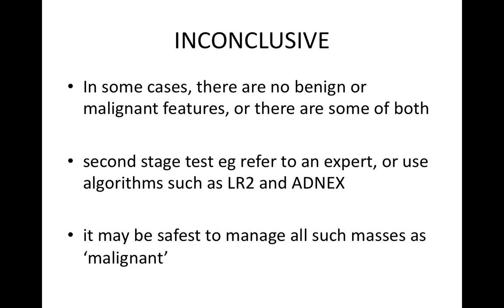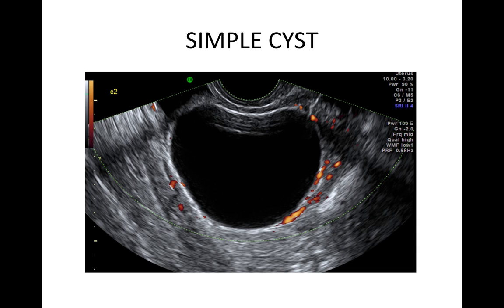The next few slides will show examples of common pathology with some videos. This is a simple cyst. It is unilocular, does not have any solid material, has anechoic contents, no shadowing and only minor vascularity. It was a paratubal cyst on histology.